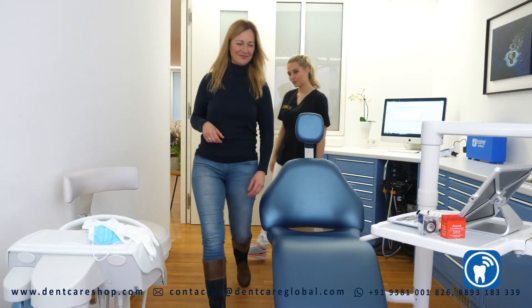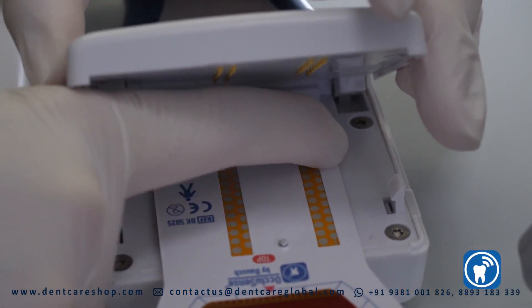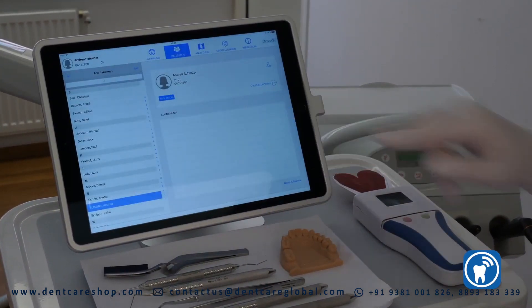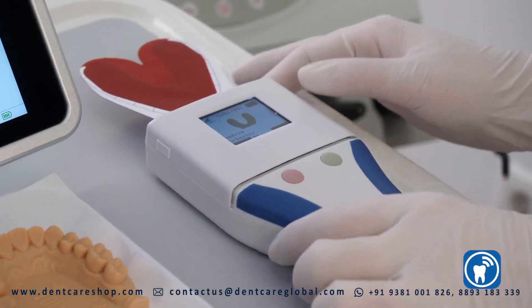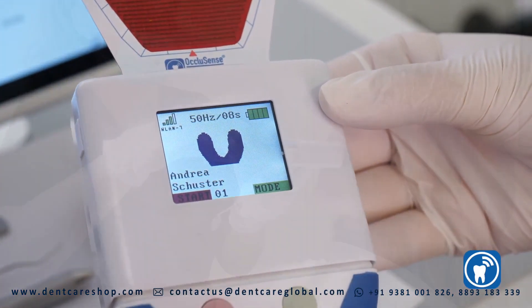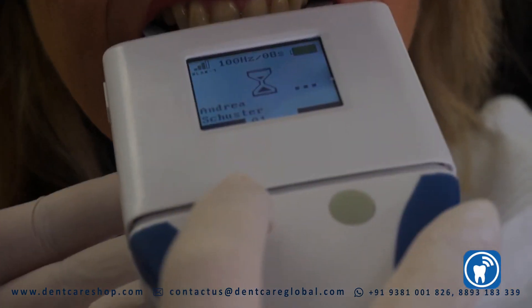The disposable pressure sensor is being applied exactly like a conventional occlusion test foil. The patient's masticatory pressure distribution is being recorded digitally in 256 pressure levels. The data of the occlusal masticatory distribution is being transferred to an iPad and displayed live in the Occlusense app.